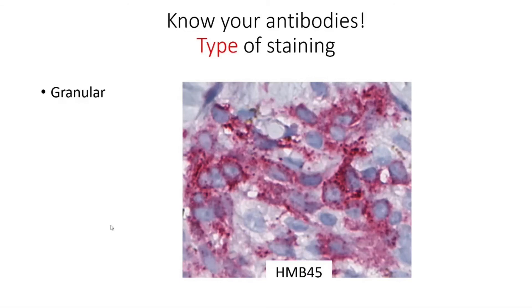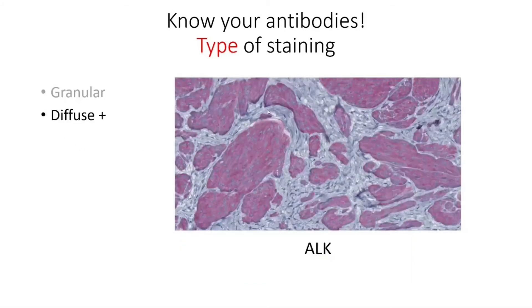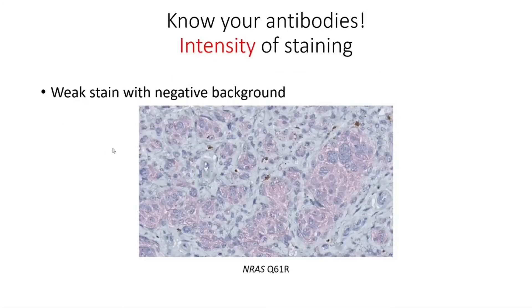You also have to know the type of staining. For example, for HMB45, you're going to expect a very granular type of stain. Otherwise, it can be a diffuse positivity, for example here for ALK in this plexiform Spitz. In some cases you will have a weak intensity but a completely negative background — this is usually what you will have for NRAS Q61R. You don't need more staining than this to call the case positive.